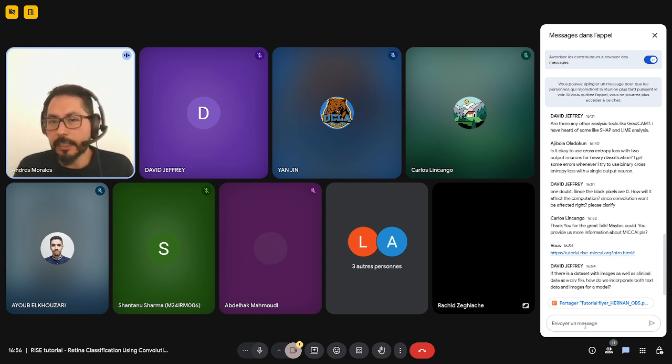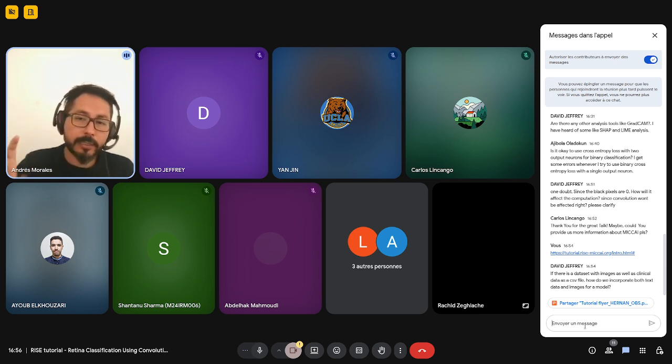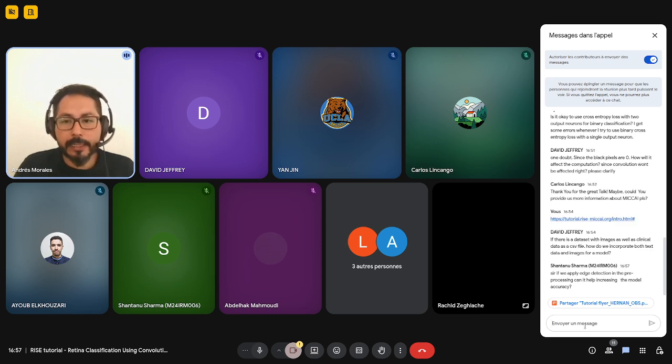So you have multimodal inputs at the end: some text with the clinical data, and then you incorporate this. This is one option. You somehow have to first change the clinical data to numerical data, to categorize it, depending on what data you are talking about. You can either go through another neural net, for example, and then just combine the last two layers of the two models to make the final classification, or you can put it directly into the model. There are, of course, more elaborate strategies nowadays, but this is more or less the general idea. But this is totally possible.